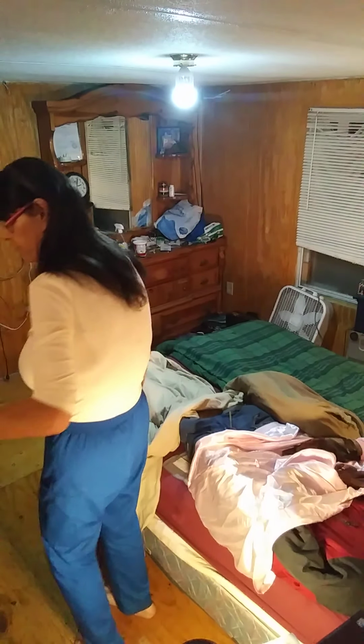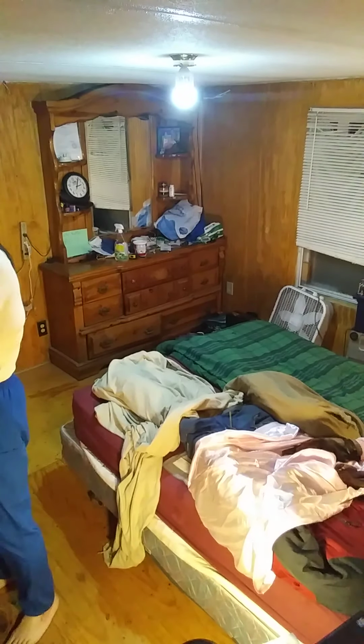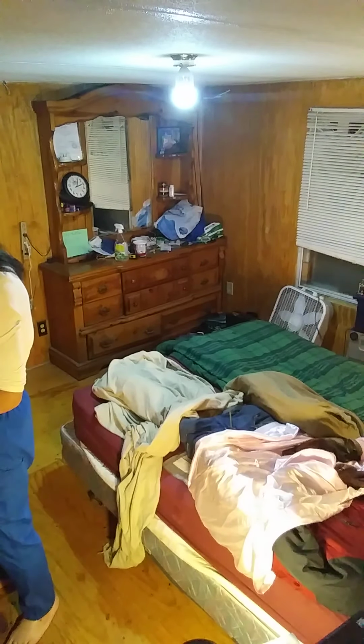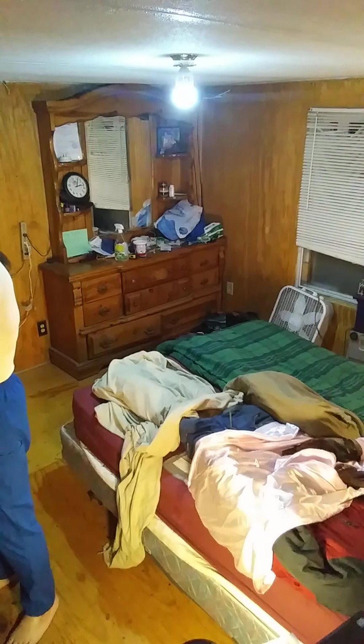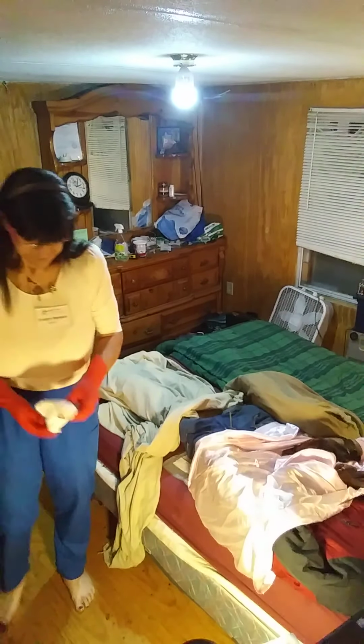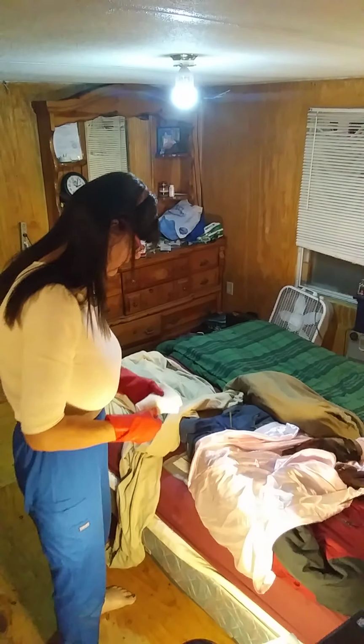Then I'm going to go for another wash towel. This one's just going to be plain water. We're going to rinse. Wash, rinse, dry. Okay? So I wring out the extra water. And I fold it into 4ths again.